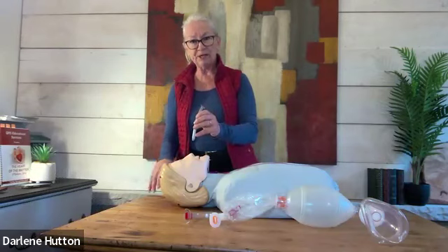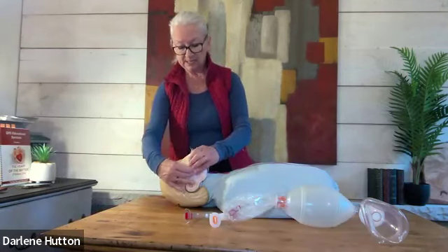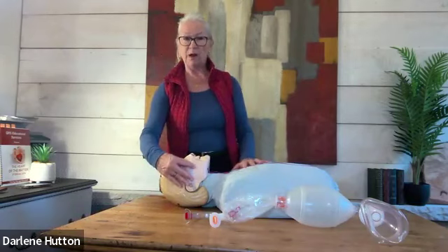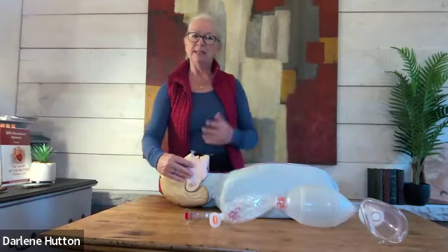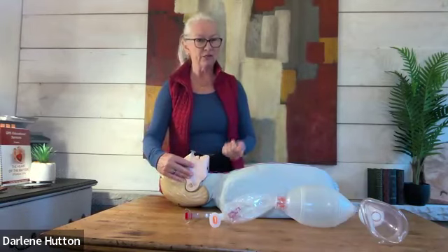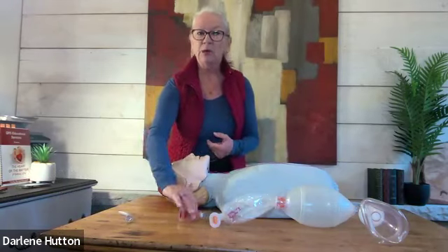For the nasopharyngeal tube, you're going to insert it straight down until you are seeing it just at the tip of the nostril. If you feel any resistance, do not push past that because you don't want to cause a bleed, let's say from a polyp.